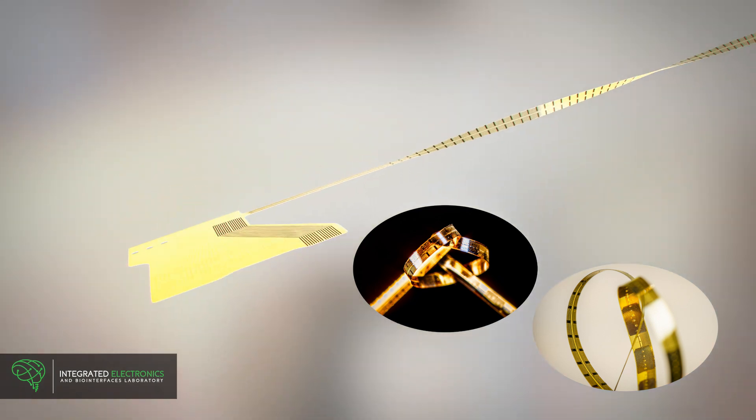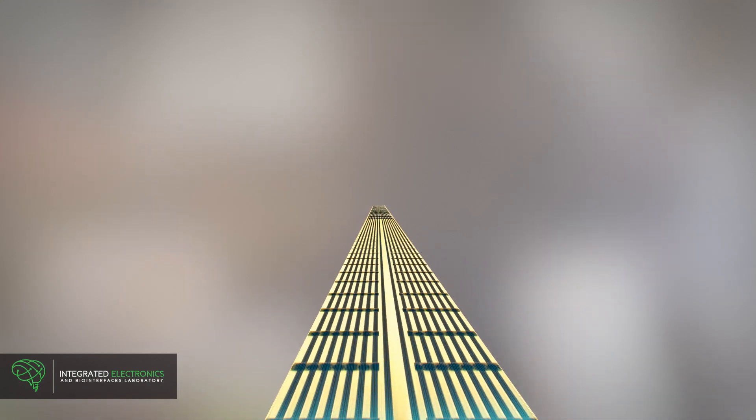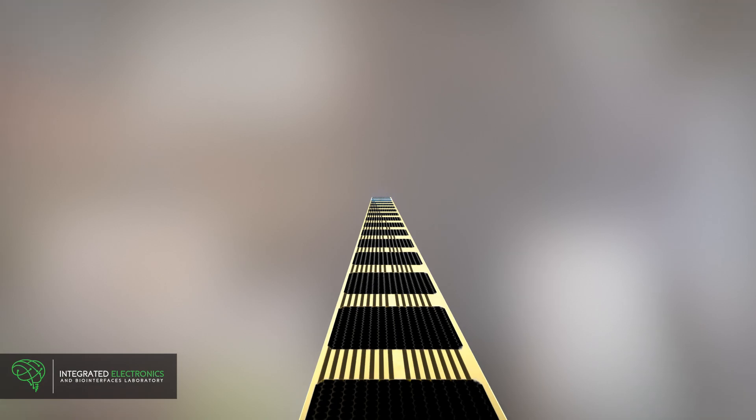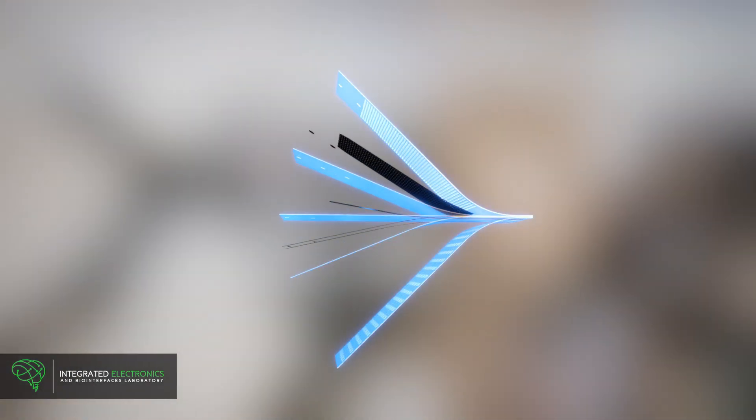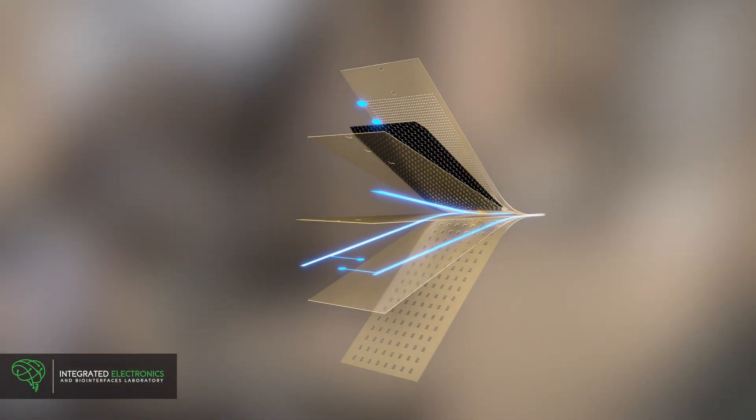The UCSD-Micro-SEEG is highly flexible and functions as a two-way traffic system: one way for recording brain activity and another for stimulating the brain, all insulated by six biocompatible polyimide layers with a total width of 1.2 millimeters.